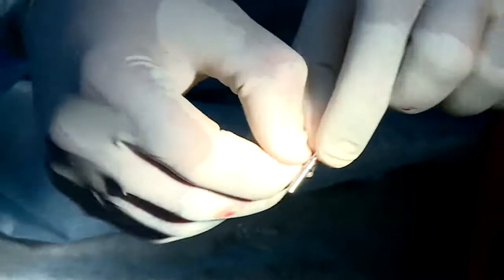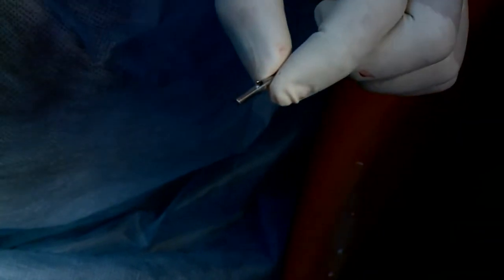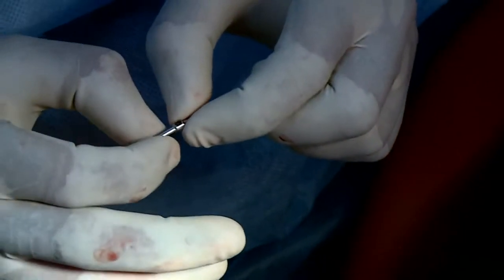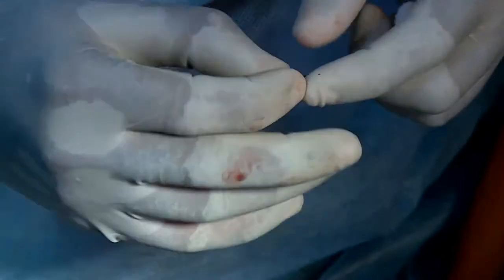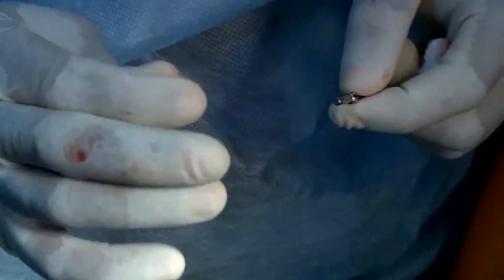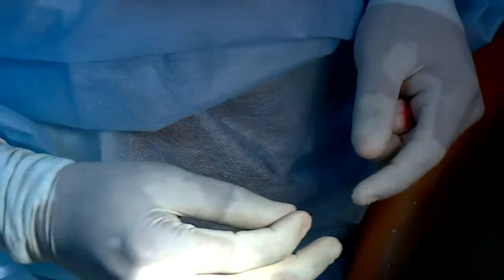Most of you who have done root canal treatments will find that all your files and reamers also have a hole. Theoretically, they all have to be tied to a dental floss, because these are small pieces which can slip. Should it slip, if a patient swallows, no harm done, but if the patient aspirates it, it can become an emergency. So particularly when we have a patient who is numb, we have to be extra careful.